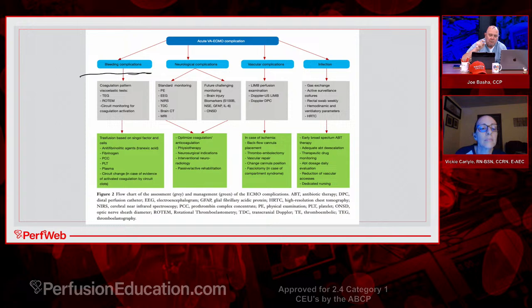I do want to mention something real quick. It's not part of my lecture, but it's very important that people understand this. The only way you're going to really know if your oxygenator is getting full of clot is to measure your intraoxygenator blood volume. And the only way you can do that is with the Transonic ELSA meter. That's a separate aside; you guys can look it up and do whatever you want with it, but that's just a reality.